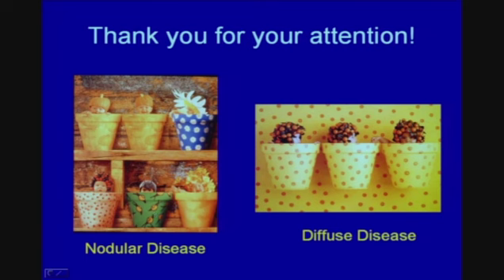In the setting of diffuse disease, I think there are just very, very subtle differences and overlap, but it's a very nice challenge for me to examine these patients and try to be useful in trying to identify some of the complications and some of the non-suspicious findings.